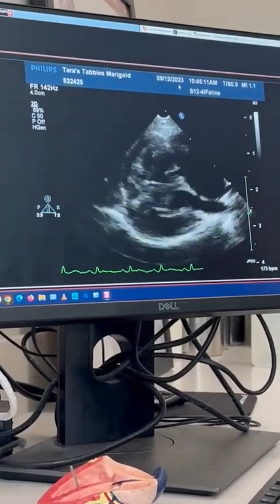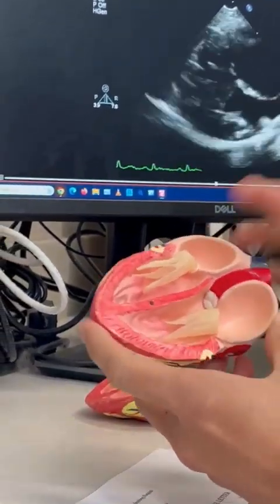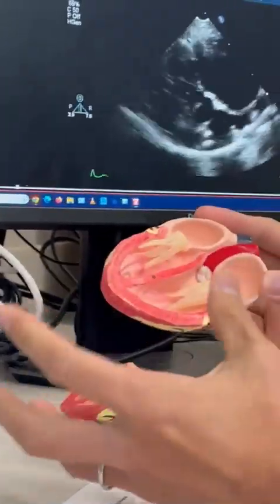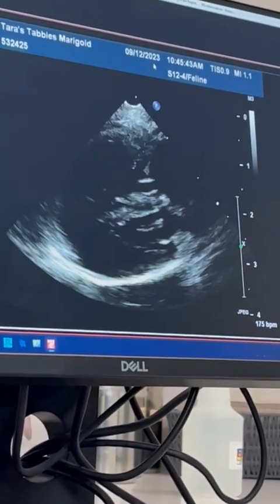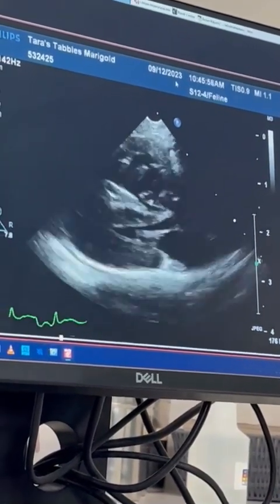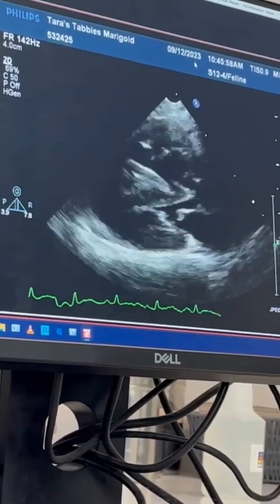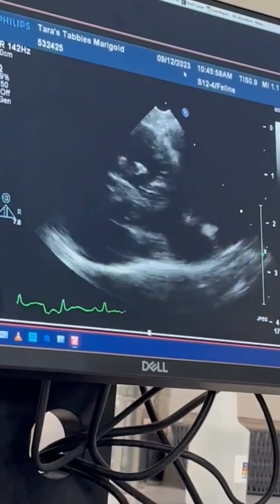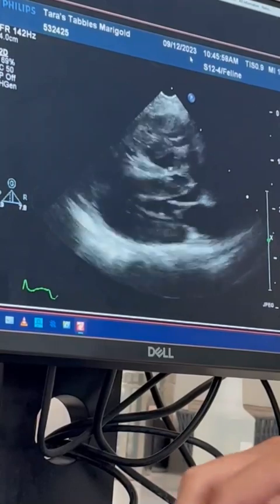Essentially, the heart ultrasound is a cross-sectional image that depends on the angle of the probe, which gives us different echocardiograms. Briefly speaking, she does have a complex congenital defect called tetralogy of Fallot. It comprises multiple structural defects.